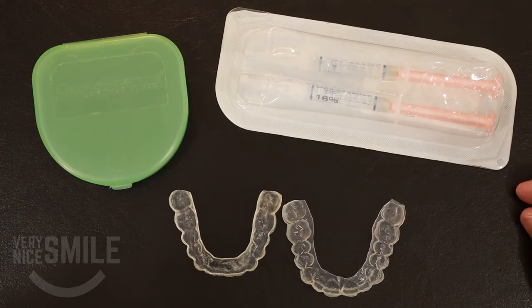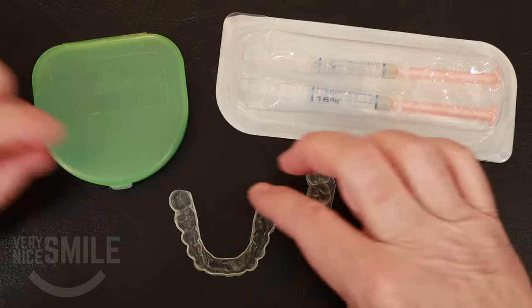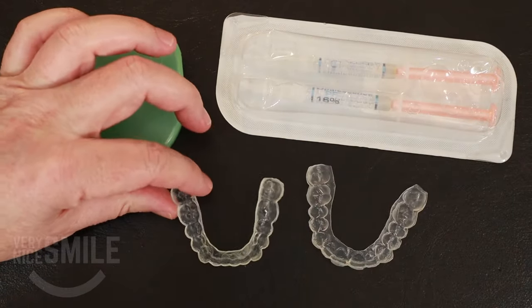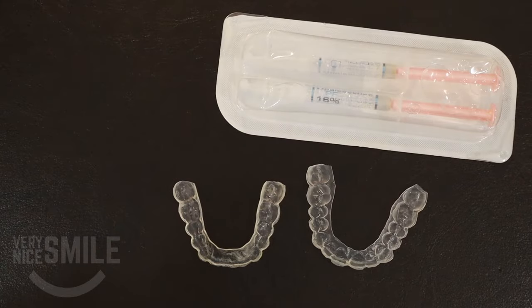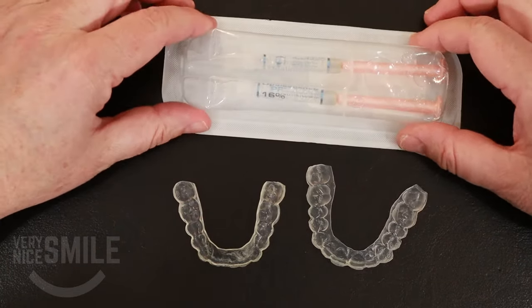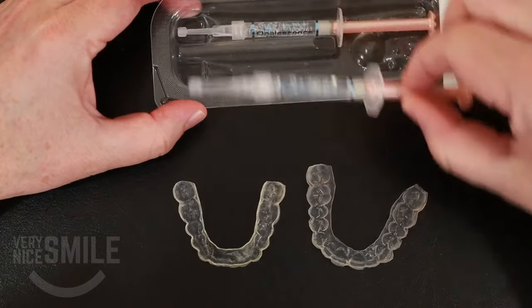So here we have my custom whitening trays — got my upper tray and my lower tray. It's just a storage box. I'm going to put that off to this side, and here's the bleaching gel. Let me take out some of the bleaching gel, take a tube out.